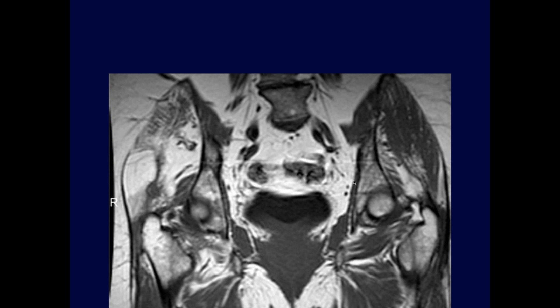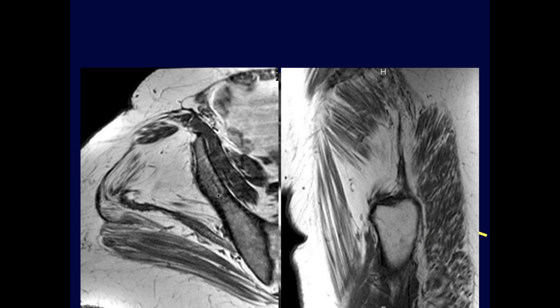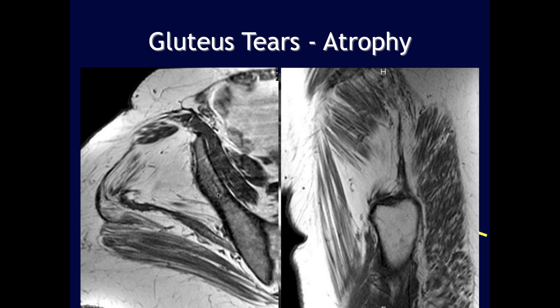Significant atrophy of the right gluteal musculature is noted. There is no good attachment of the gluteus medius, indicating a tear, and some partial tearing is also present on the left side. This represents severe bilateral asymmetric muscle atrophy due to chronic tearing of the gluteus medius tendons with subsequent disuse atrophy.